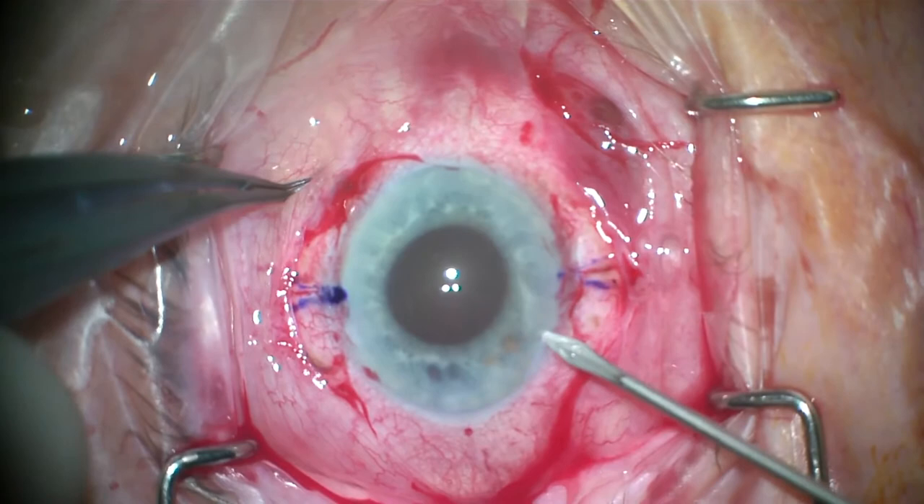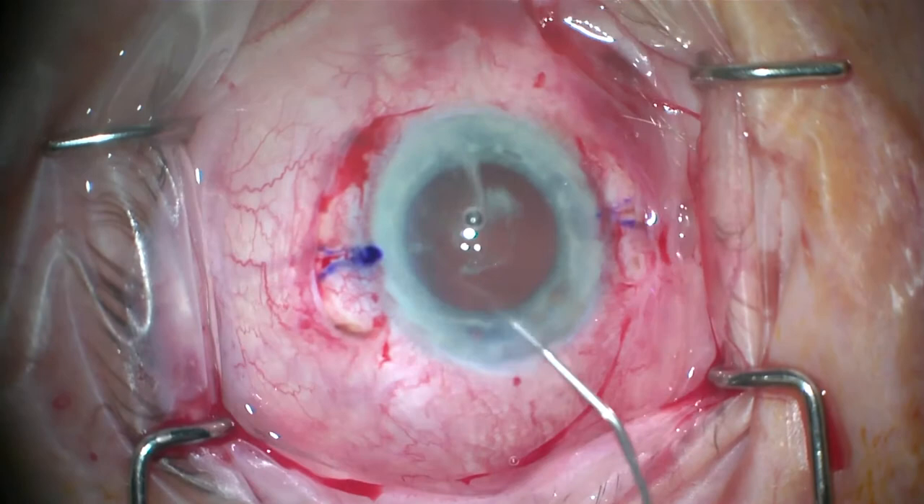Triamcinolone is inserted followed by anterior vitrectomy to ensure that there is no residual vitreous.